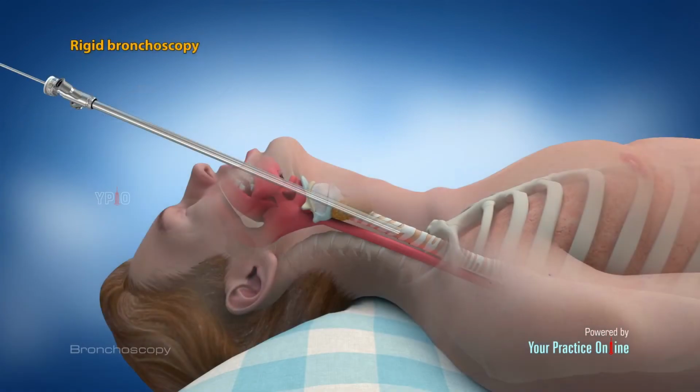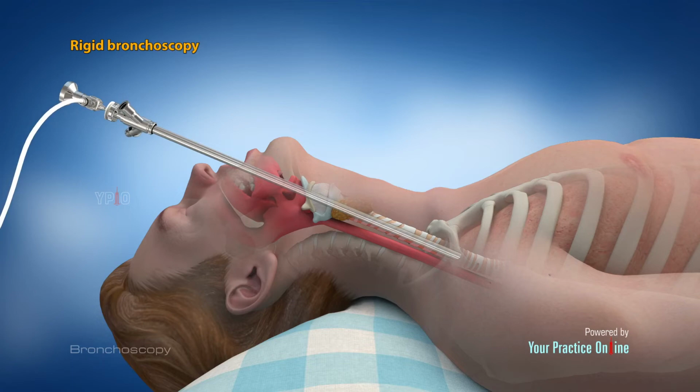A rigid bronchoscopy is performed under general anesthesia. Your neck is extended and the bronchoscope is gently inserted through your mouth and windpipe. Biopsy samples are obtained and the airway is washed with saline.